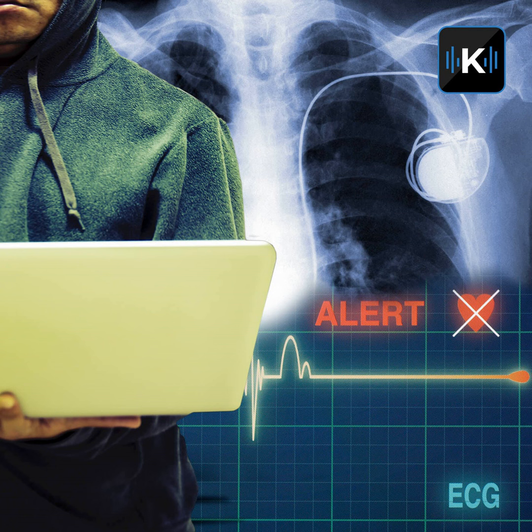They do have some limiting factors that they have to deal with. Like, it's not easy to pull a device out of someone's chest and replace it, right? So it's not easy to push out updates to medical devices that are supporting someone's life, right? So I think for the most part, the majority of the manufacturers we're working with are pretty receptive, but a handful maybe aren't. And in Billy's case, there has been some success.